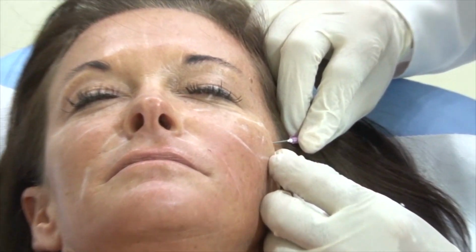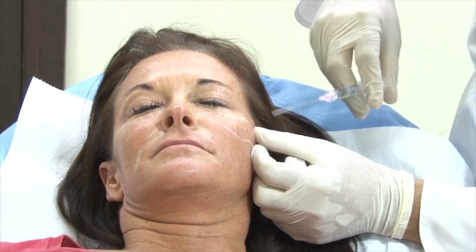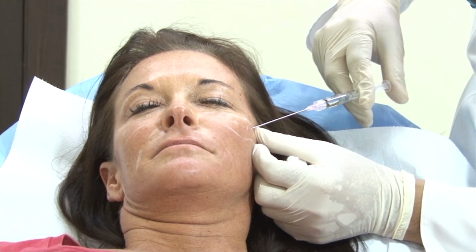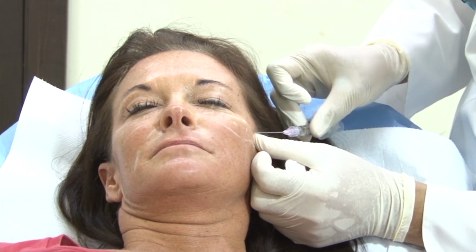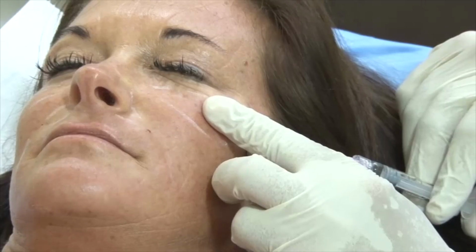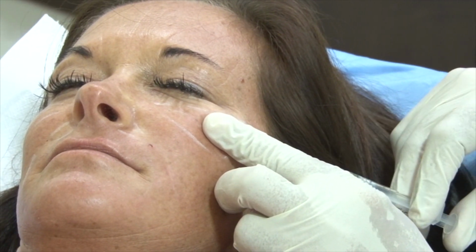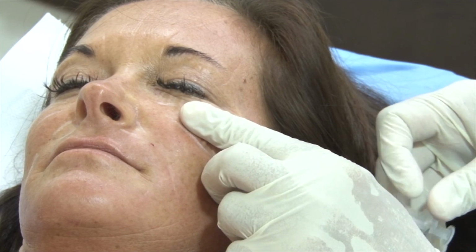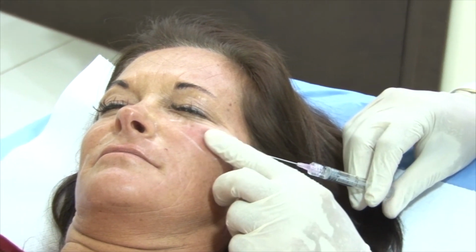Usually one attempt should be good enough to place your filler. This minimizes trauma and post-operative swelling. Similarly on the other side, a needle prick, a gentle wiggle movement. Make sure it is placed deep, and then placing the filler above the periosteum.